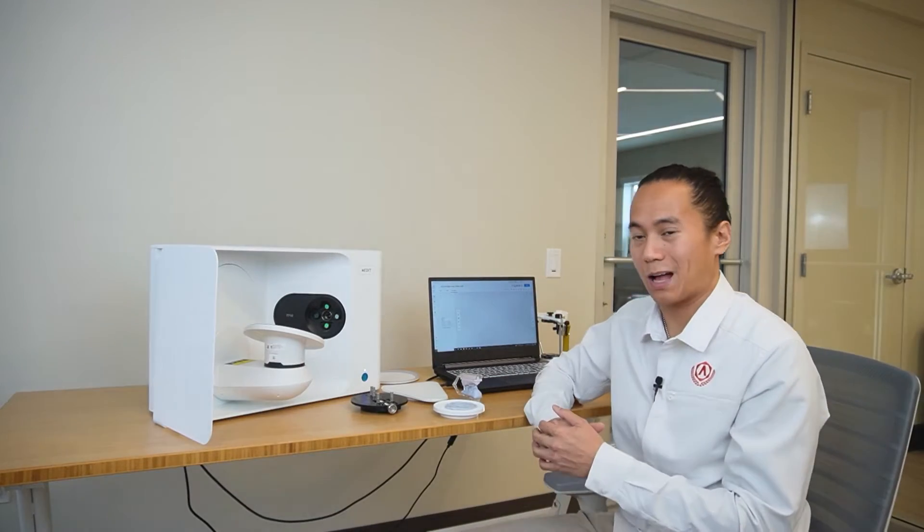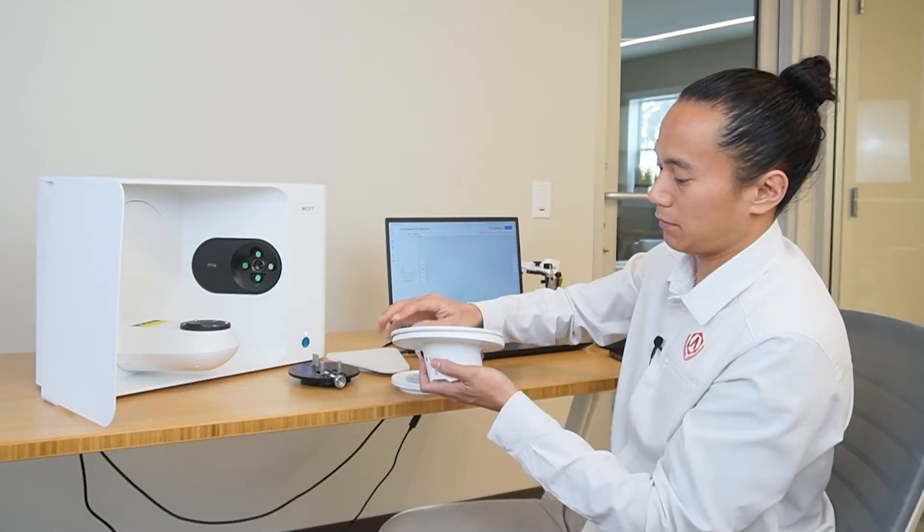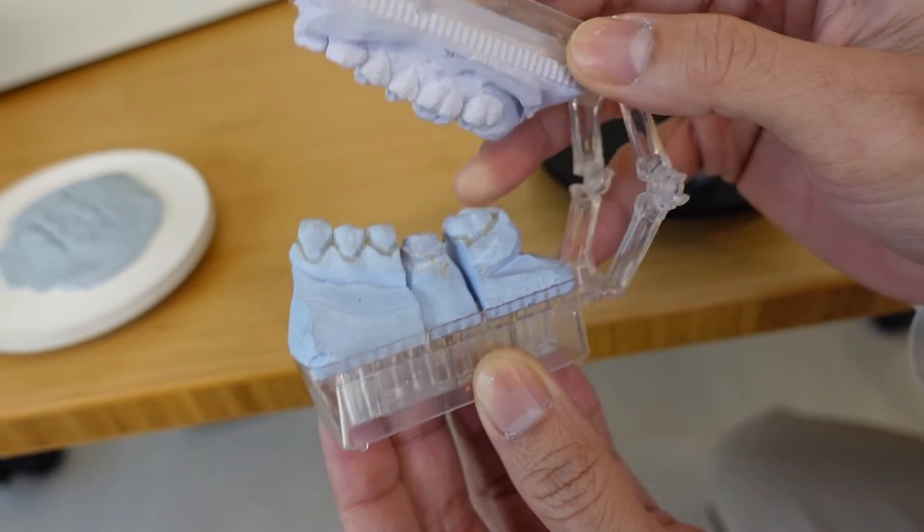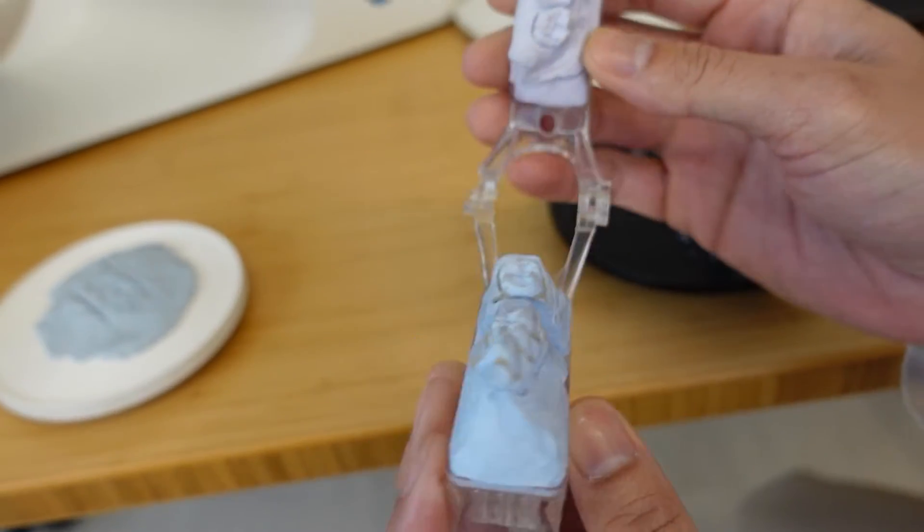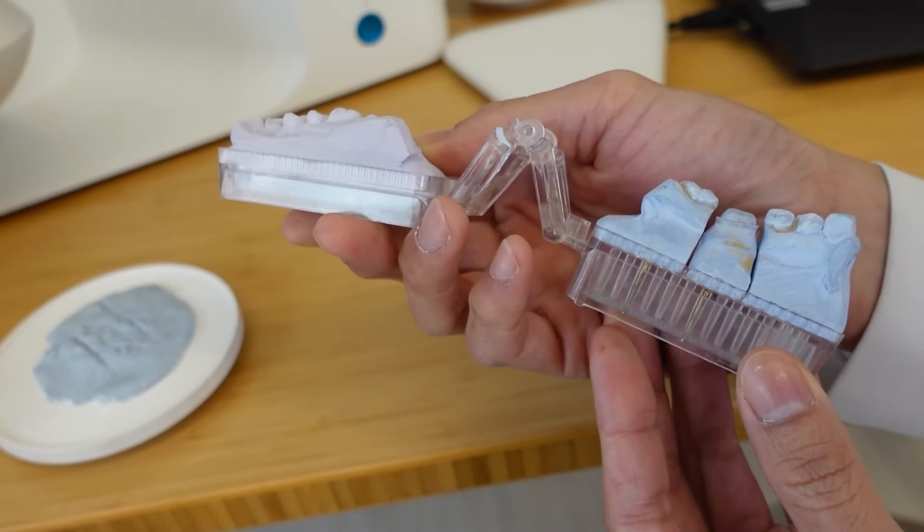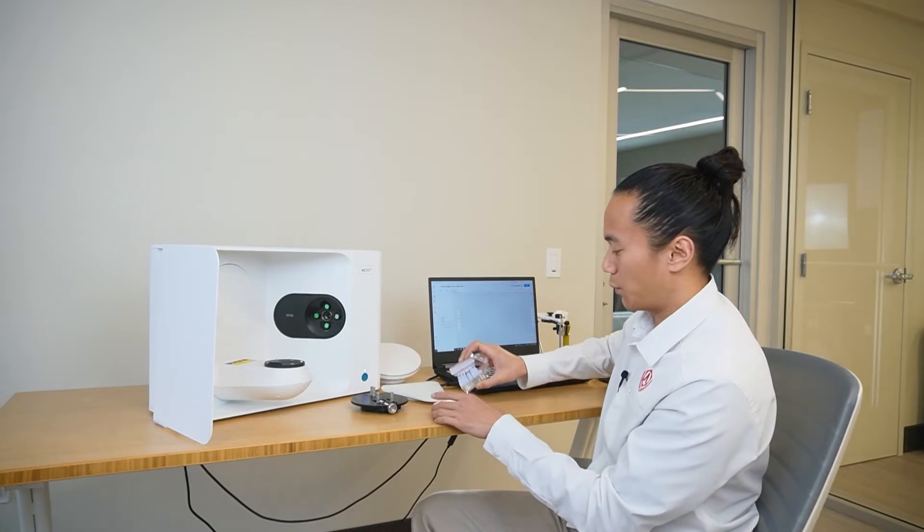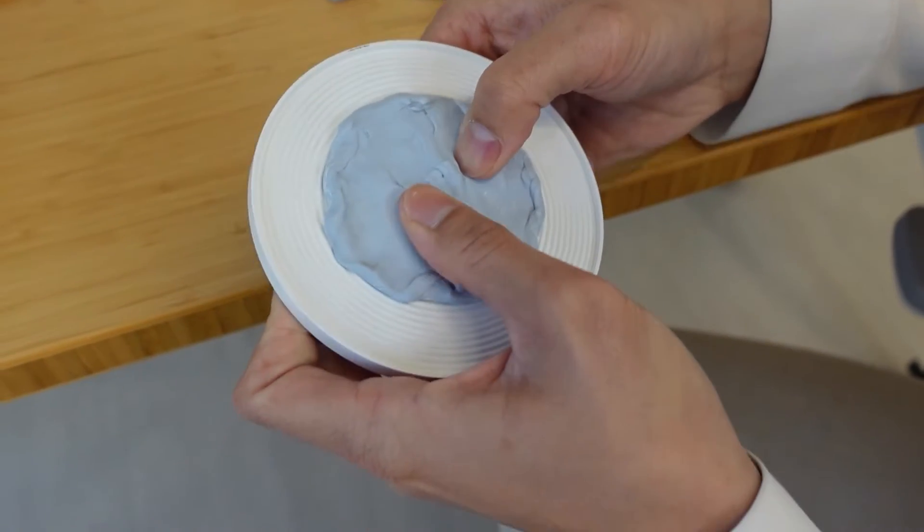Now that we've finished the calibration process, let's go ahead and put away our calibration plate. We'll put this off to the side. And the first case that we're going to be demonstrating today is going to be a single unit crown. I have a Quadrant model here that's already been prepped for dies.